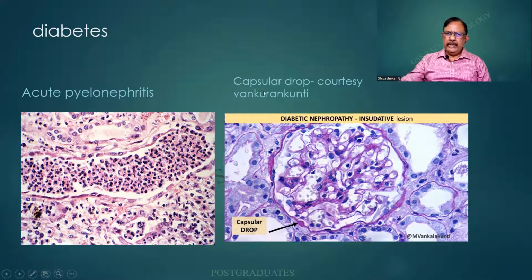Hyaline caps I have mentioned. There is another condition called capsular drops, as though something is dropping from the parietal wall, a capsular drop. Thanks to this person whom I have mentioned over here.